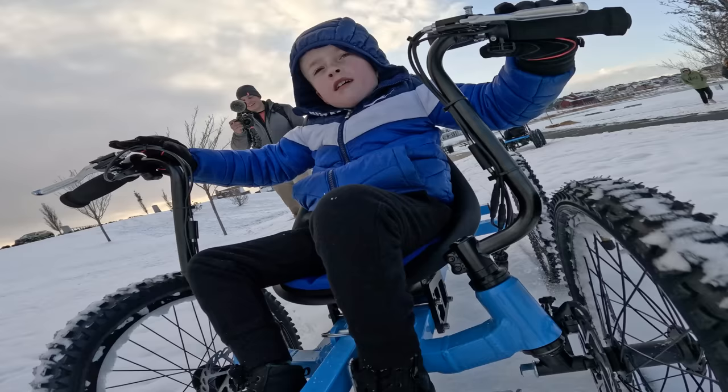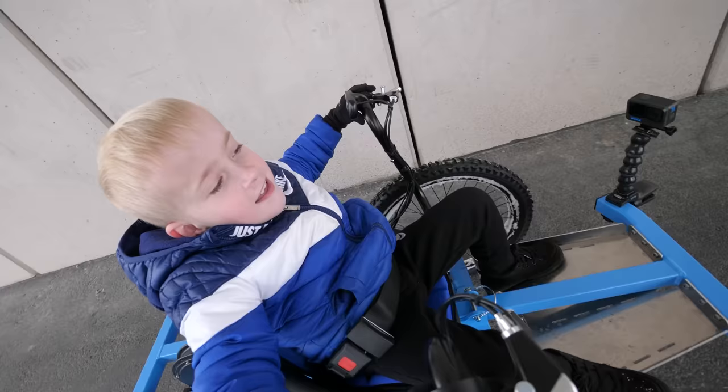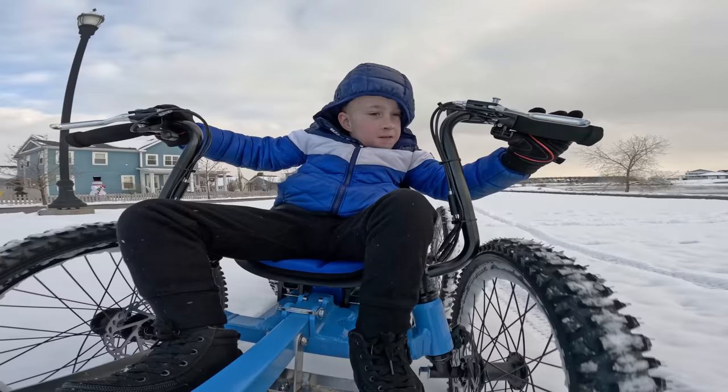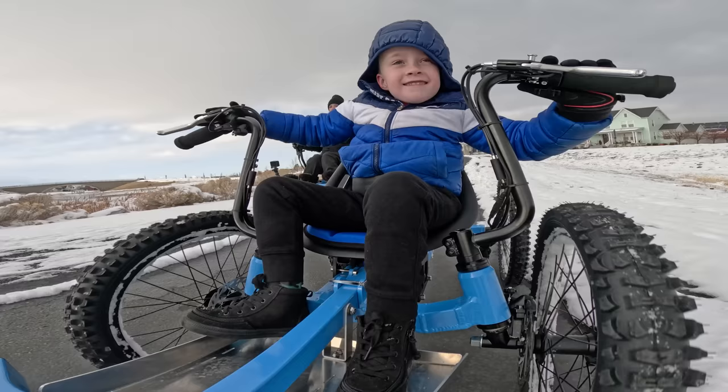Hi, can I pet your dog? Ollie! Look at this bike. This is the best day of my life. I'm cutting you off. Kid Rig! This is the best day of my life!